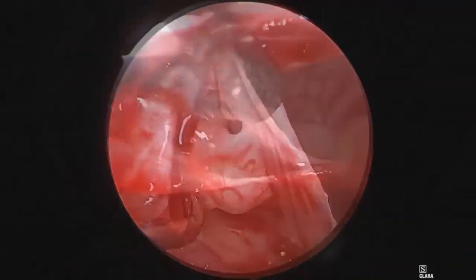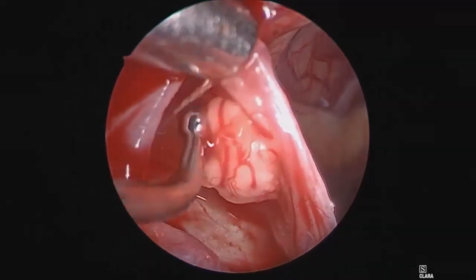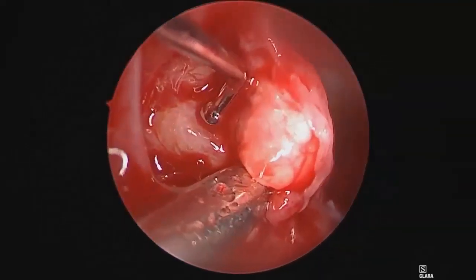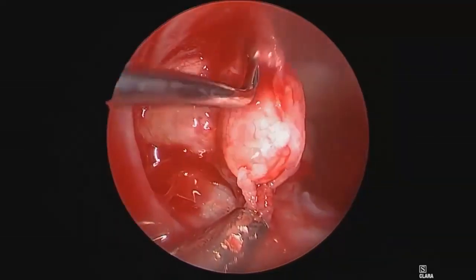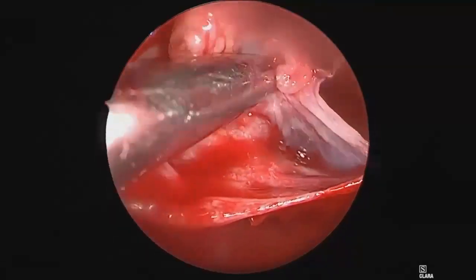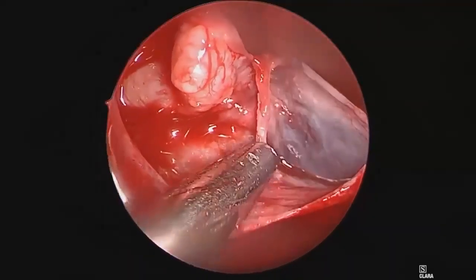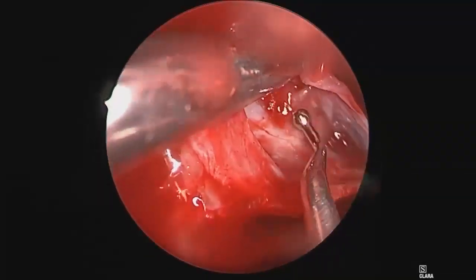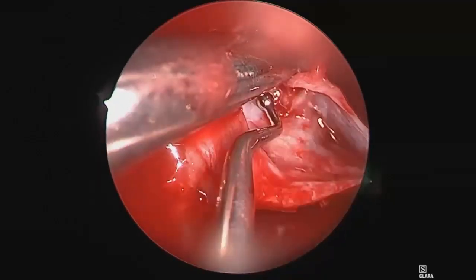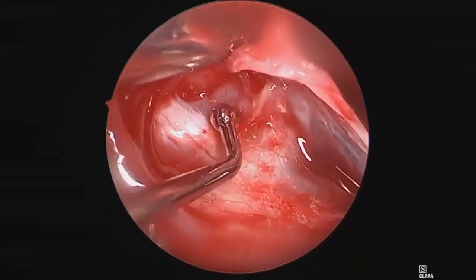Therefore, careful technique is mandatory. Once the residual dermoid is dissected bluntly off the carotid, safe planes are elevated and isolated in order to allow for sharp dissection and complete removal of the dermoid that's implanted in this area. Dissection in this area can be tedious and challenging. This requires patience and good surgical technique to remove this last remnant of dermoid that's attached to the critical neurovascular structures in this area.